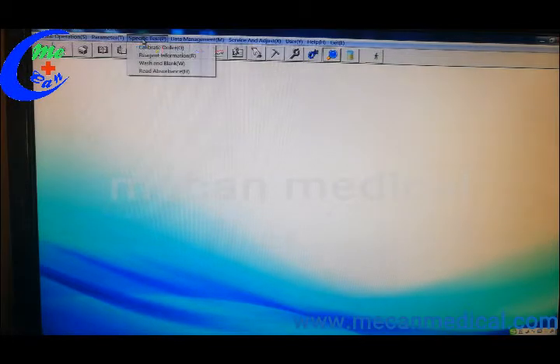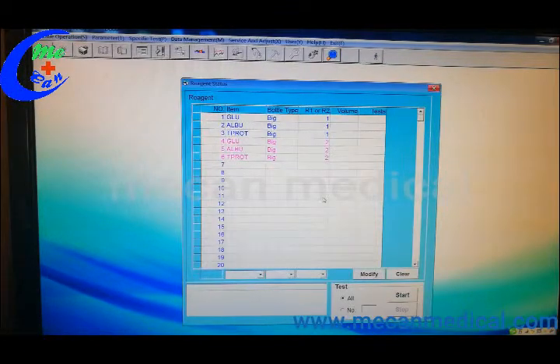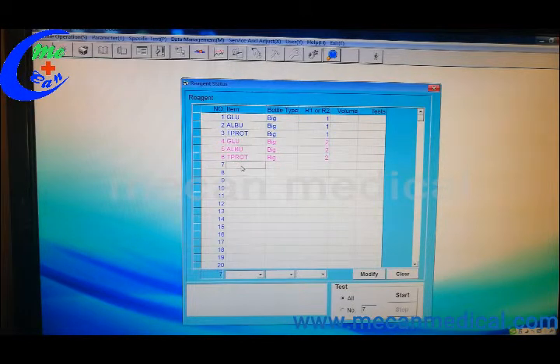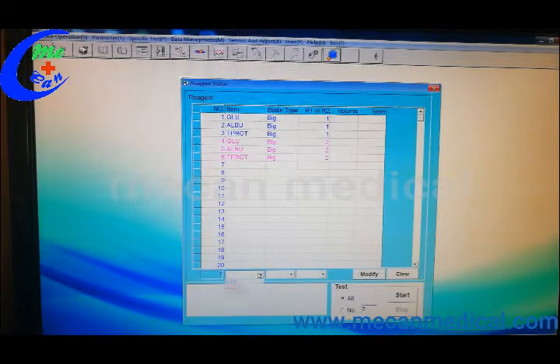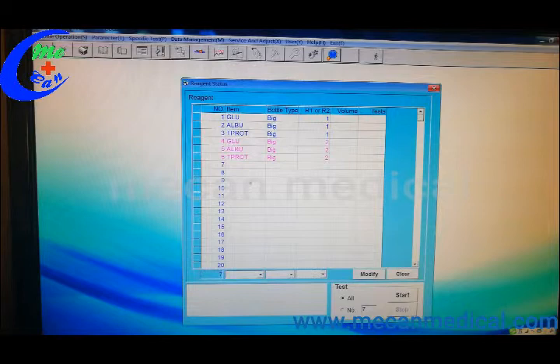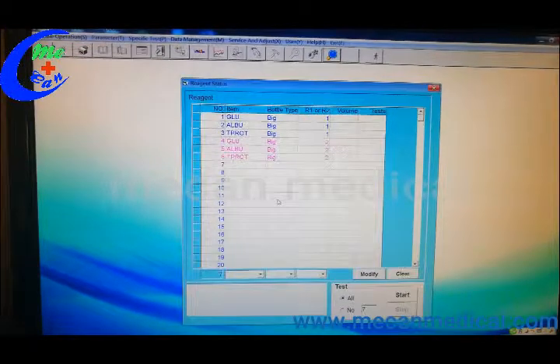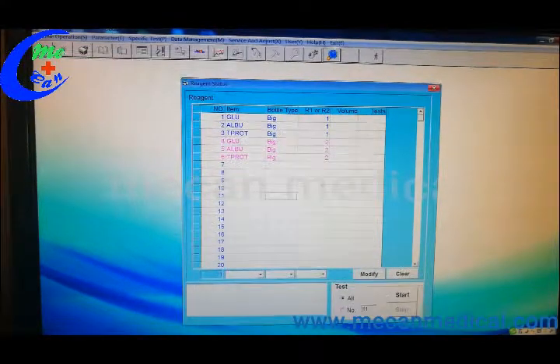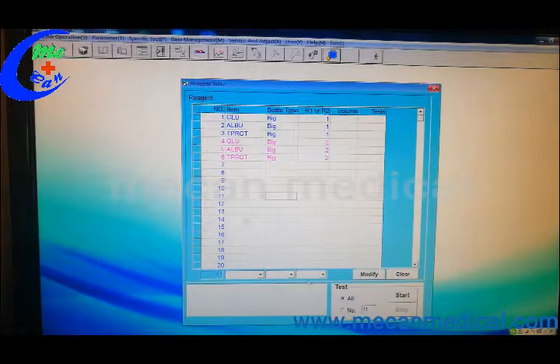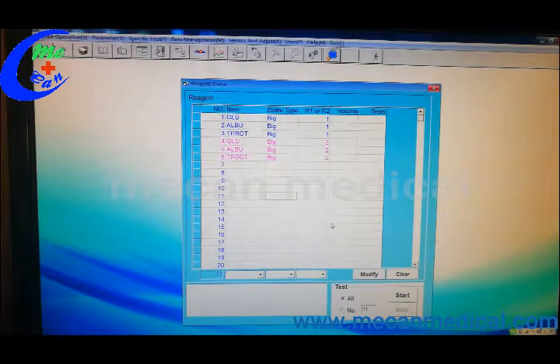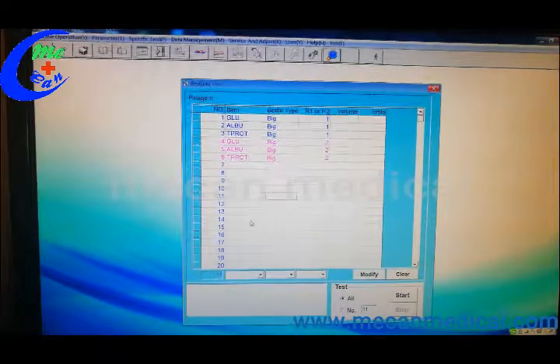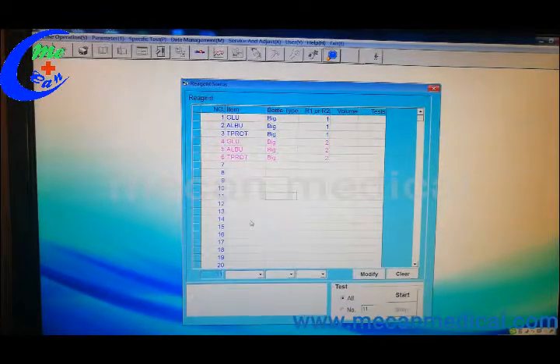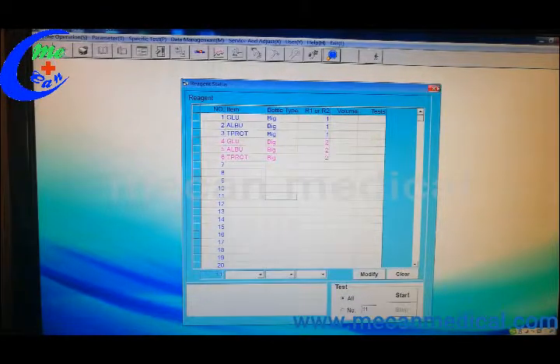And then you should go to the reagent information. Put the items from here and choose the bottle type and R1, R2. So this reagent information shall be same like the reagent tray where you put the reagent.